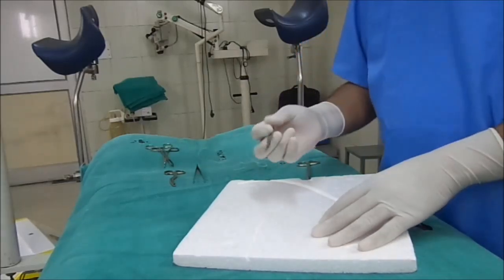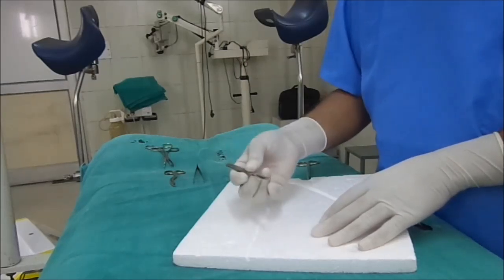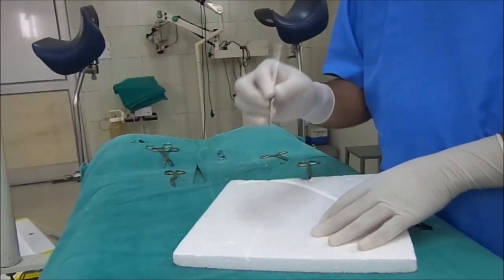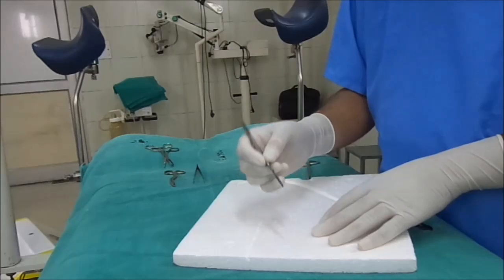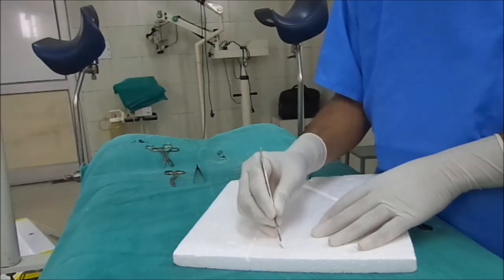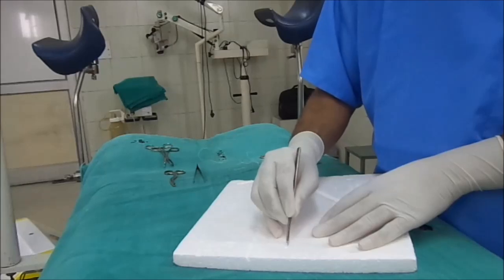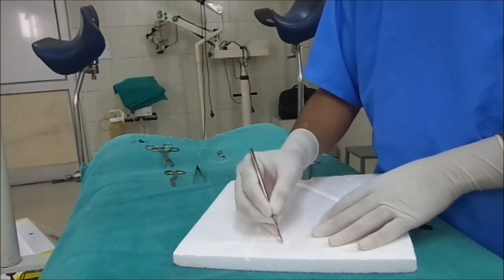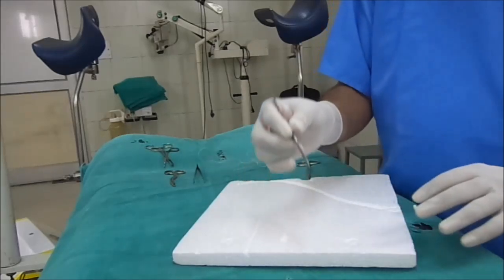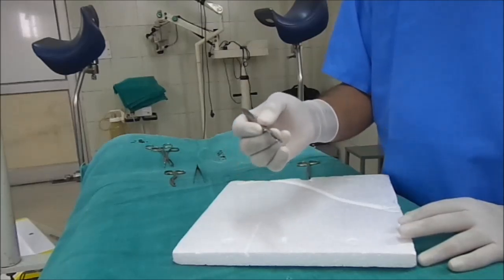When we require high precision and an elliptical incision in superficial pathology and for cosmetic purposes, we hold the scalpel just like a pen, so that you can make a high precision incision in this way. In that condition, you hold the scalpel just like a pen.